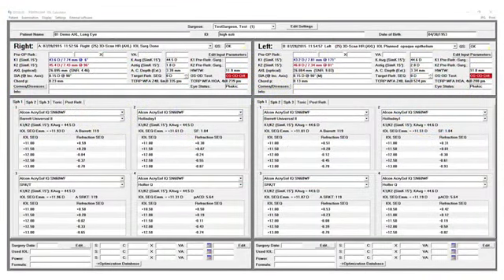With the Pentacam AXL, we've added not only the axial length, but we do have our IOL calculator built in as well. The IOL calculator is good for any type of eye, whether it's a normal cornea, whether it's post-refractive, or for corneas with astigmatism where you would like to implant a toric. So we do have our toric calculator as well.